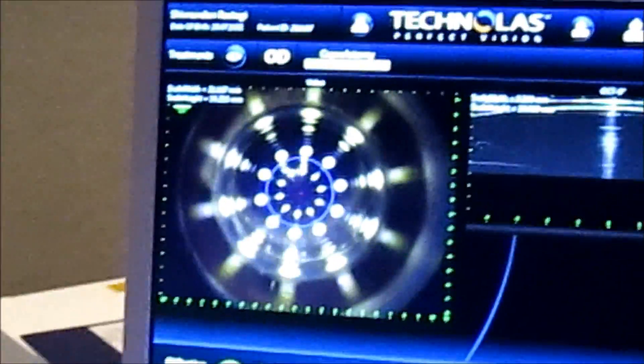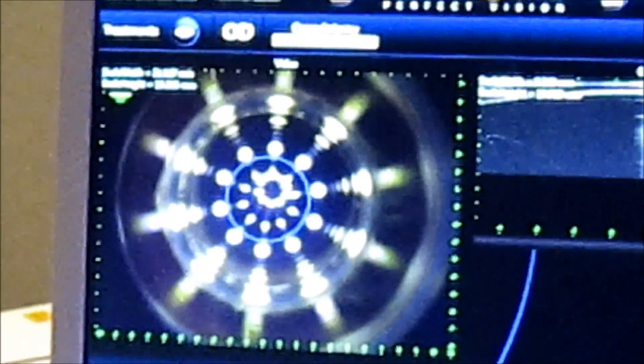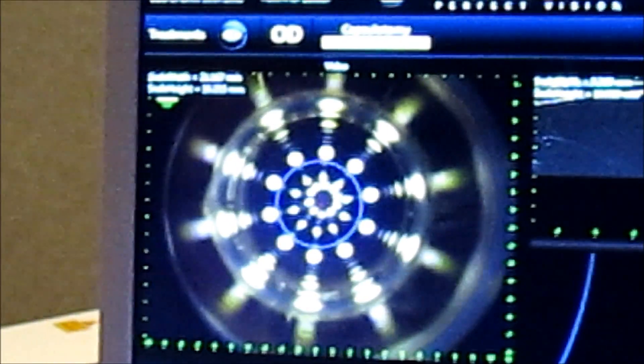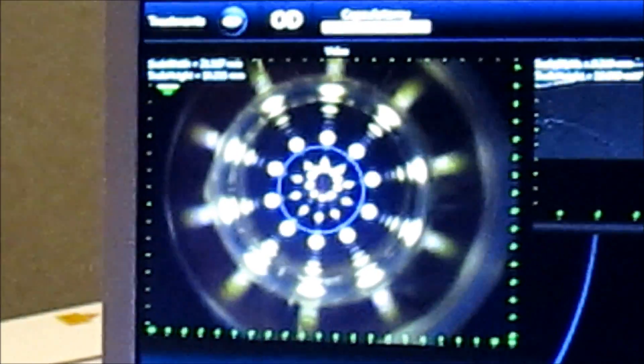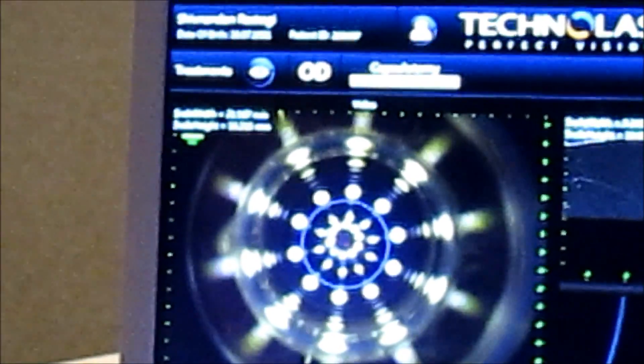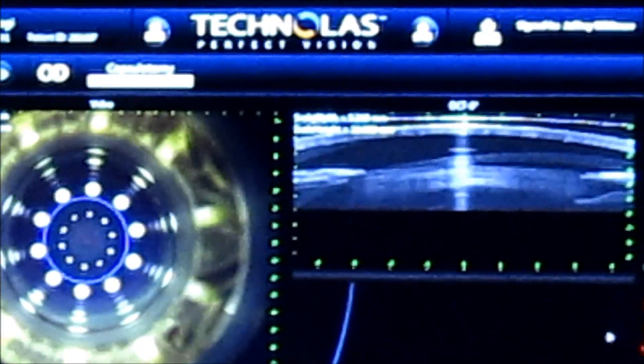Then we'll bring the cone of the laser down into the center of the vacuum ring. We can see this secondary circle of light within the dotted ring. We want to center that with the bed controls as we bring the bed up, bringing the patient's cornea or vacuum ring up into the cone of the laser to get good applanation.